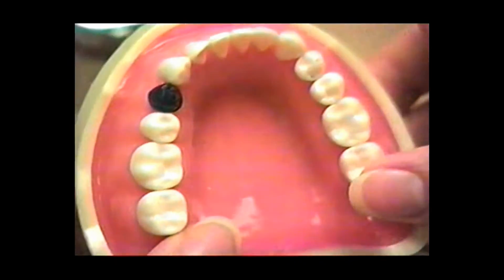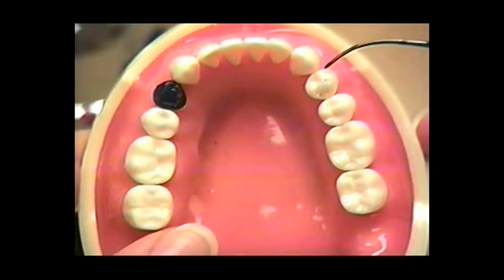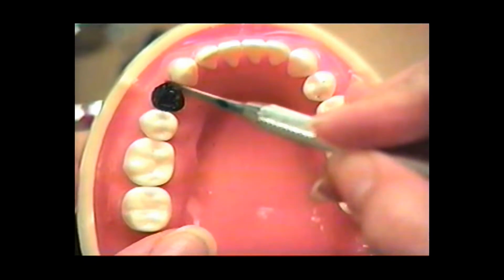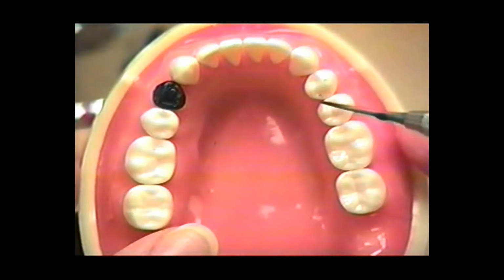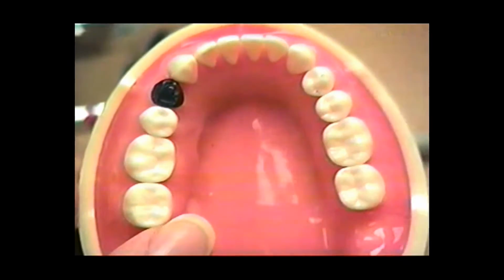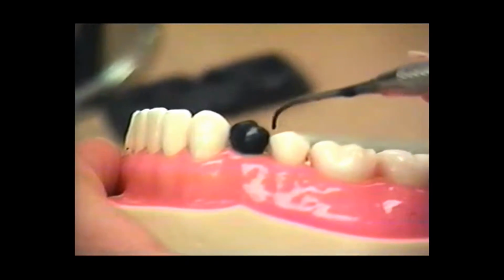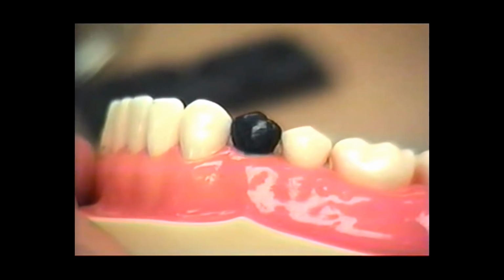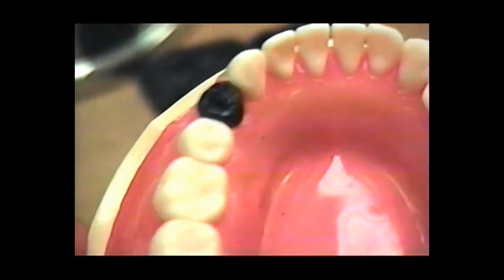When I do my embrasures, I do look at the contralateral tooth, and I do look and see what this embrasure looks like, and am I matching that over here on this side for your facial embrasures and your lingual embrasures, okay? And then your gingival embrasures, I've checked that, and I made sure that I don't have too much wax at this embrasure area right here, and here are right where they need to be. So now it looks a lot like a premolar, and we have to do the occlusal.